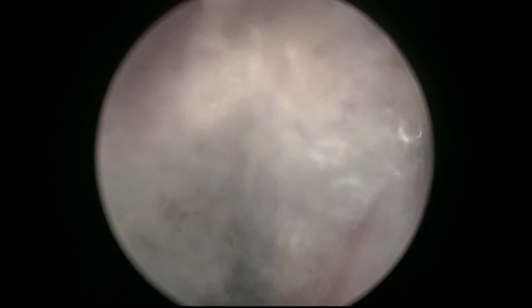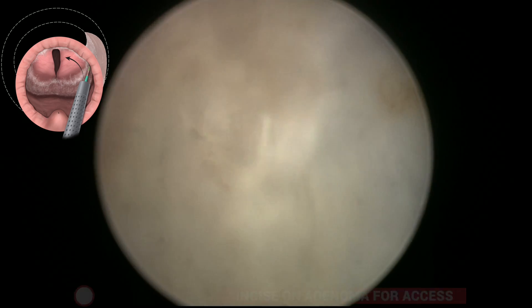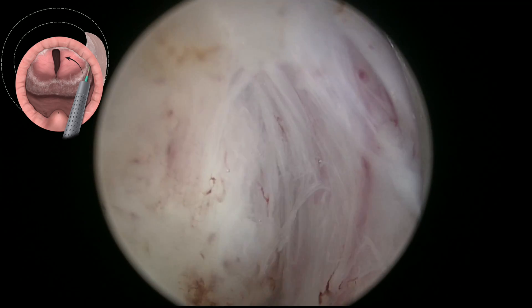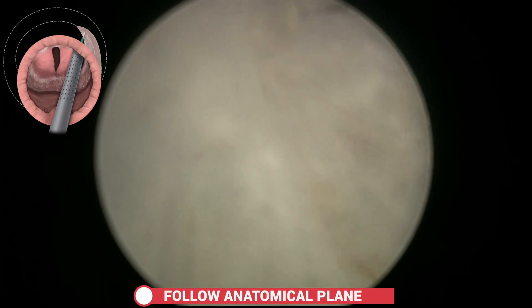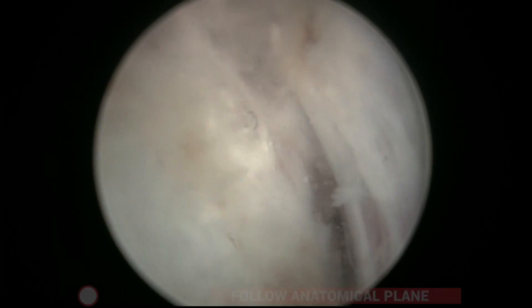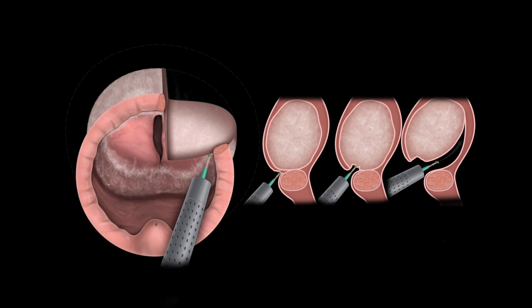Before progressing anteriorly, it is important to cut the apical attachments first. An incision is made to deepen the line and then the proper plane is sought to develop towards the anterior part. This cutting into the adenoma — this deepening of the white line — doesn't leave adenoma behind; it just gives access to find the right plane easily.